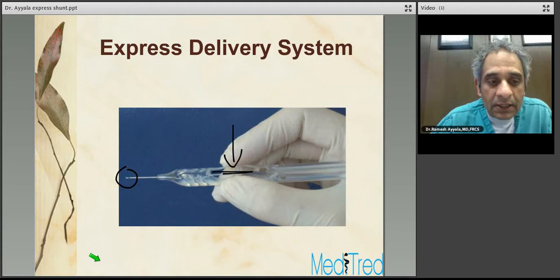The Express comes preloaded from the company onto the Express Delivery System, or EDS. The EDS comes with a spring-like mechanism. The surgeon presses on the spring right in the middle of it, and once you press it all the way down, it releases the Express at the tip of the device.